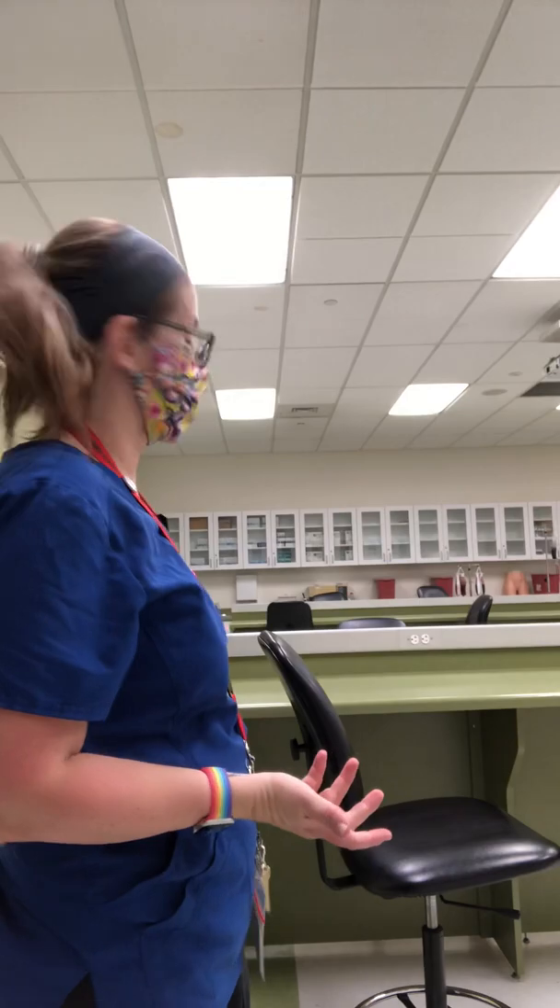Hi guys, I'm Ms. H and I'm standing in the Paramus campus in our wet lab classroom. I'm going to talk to you quickly about order of the draw. What is that? It's what order we draw the tubes when we do a phlebotomy stick on a patient. Does it matter? Yes, it matters. It's one of the most common questions we get and it's a stickler on the NHA exams — the one that people seem to stumble over the most, so I thought I would run through it quickly.